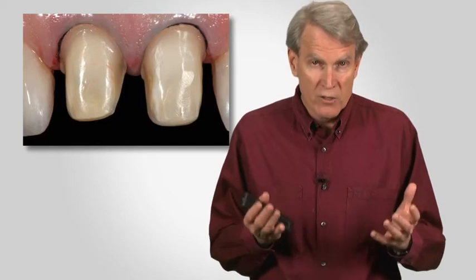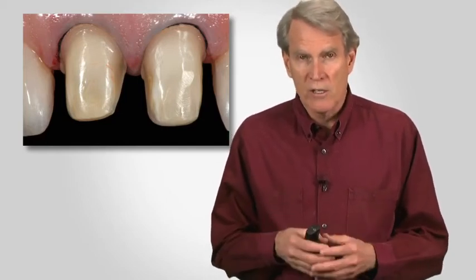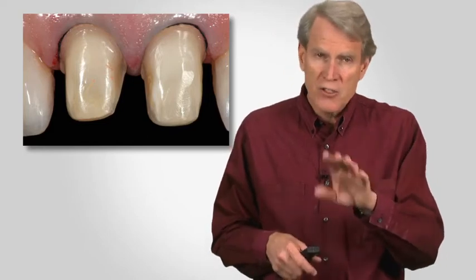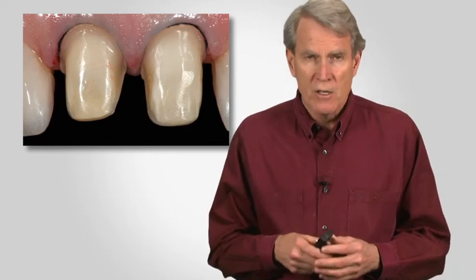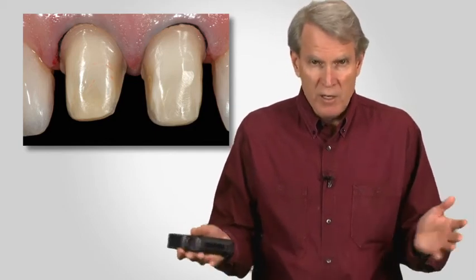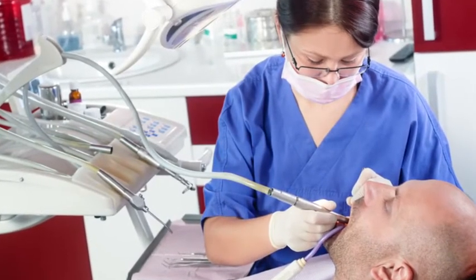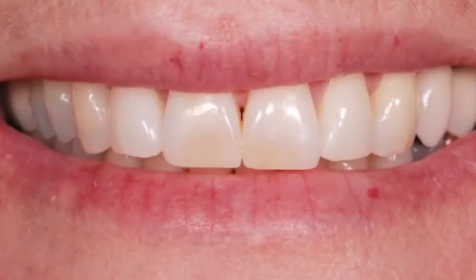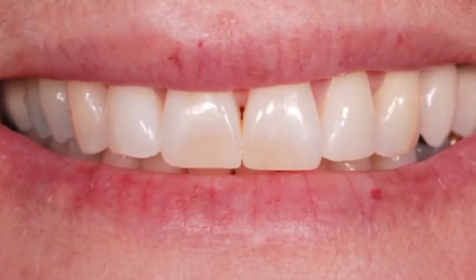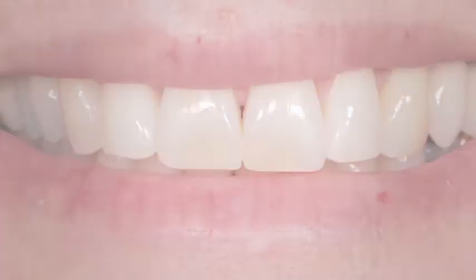Another great tool for photography is to allow us to evaluate the quality of our work. And that's true for anybody on the team that works clinically with our patients, whether it's me evaluating my preparations here, or it's photographs after somebody in the hygiene room does a scaling and root planing, or perhaps provisionals that are placed in the mouth and you take some photographs afterwards and you really get to enlarge the photo and see how you've actually done.